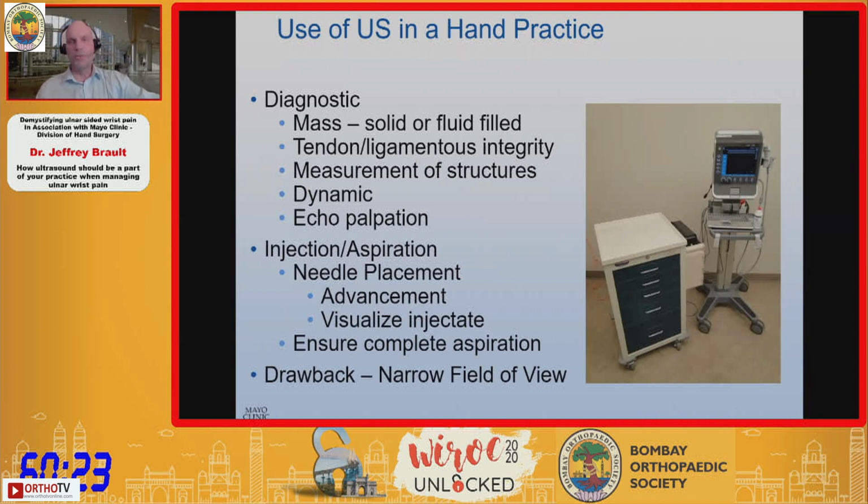So what do we use ultrasound for? Well, diagnostically, we can use it to identify masses. Are they solid? Are they fluid filled? We can look at tendons to find out if they are stable, if the subsheaths are stable. We can measure structures.